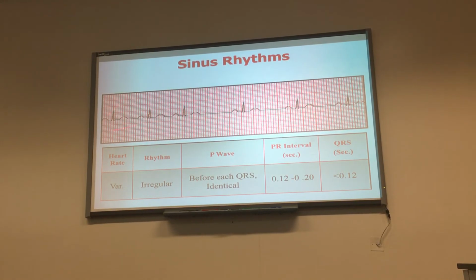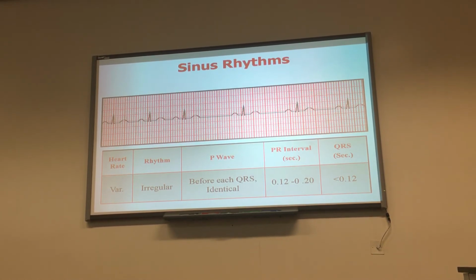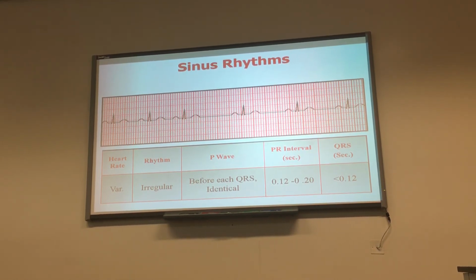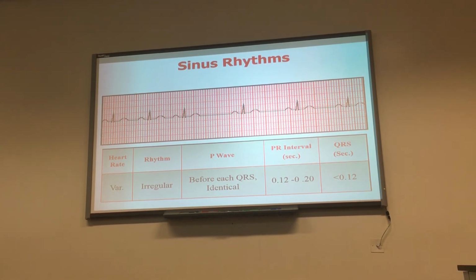So if I say this is 17 years of age, and this is the heart rate, even the machine will read it for you as sinus arrhythmia, because if you see this one, it is fast, then slows down. This is inspiration, expiration, and it will repeat itself. This is the name given to it, sinus arrhythmia, which is normal physiology. So if you see sinus arrhythmia, this is not pathology. Remember when I say not every abnormal rhythm is pathological, or we have to deal with it. This is something physiological. With age, this decreases and usually disappears after the age of 20 to 25.